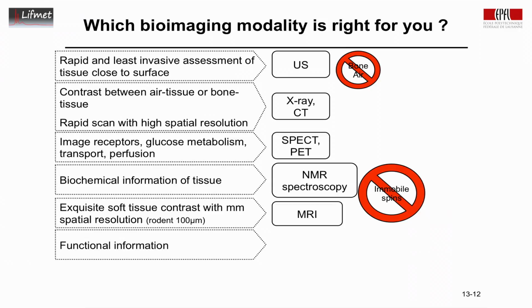If one wishes to get functional information, then the technique to use here is MRI, particularly in the brain with functional MRI or BOLD fMRI. We've discussed that. This is based on the deoxygenation of the blood vessels in the brain. It has 25 years ago replaced PET as the premier functional imaging technique. This is now being done with magnetic resonance imaging.